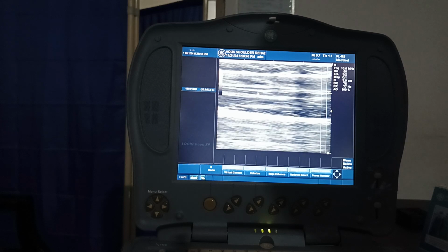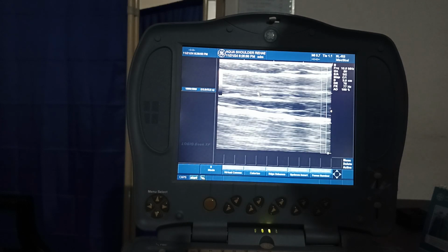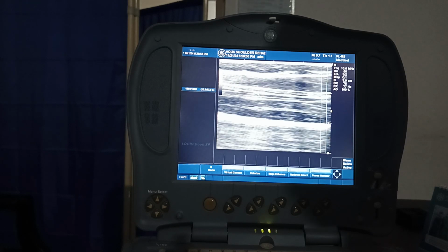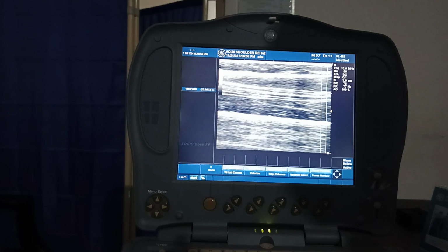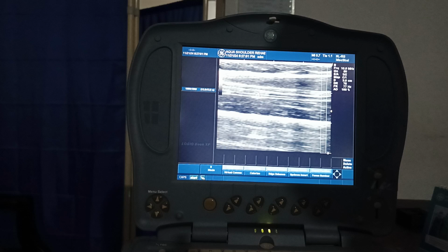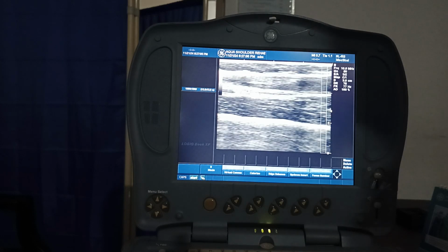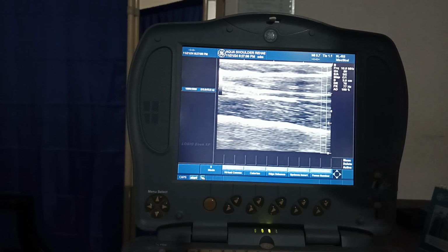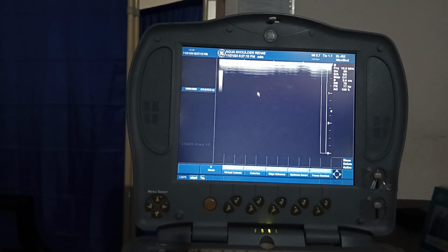With this, there is movement of the muscle as well as the nerve. So the nerve becomes elongated. We commonly perform neurodynamics, and you can see that this is better. You can see the nerve also move even with the slightest movement. So there is about 10 to 20% of stretch in the nerve that is possible. So we have till now identified the nerve and the muscle. Let's try to see how the tendon appears on the ultrasound.